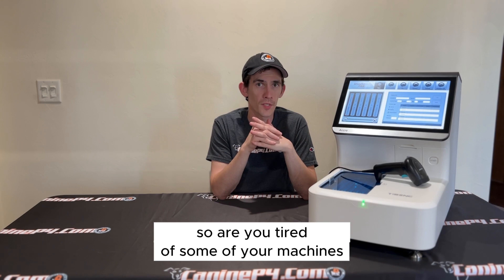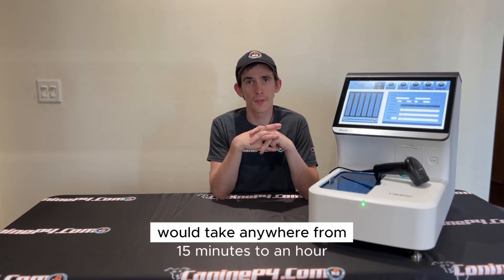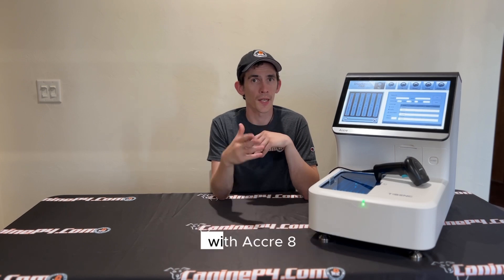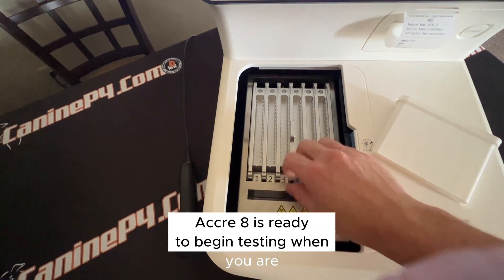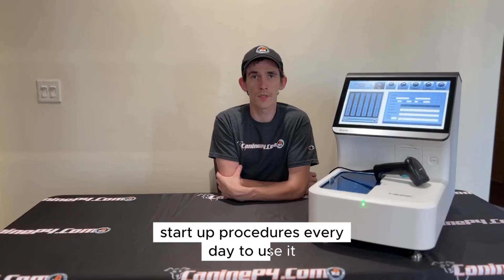Are you tired of your machines having advanced maintenance steps in the morning that take anywhere from 15 minutes to an hour? With the Accre 8, all that goes away. The Accre 8 is ready to begin testing when you are — no advanced 15 to 45 minute startup procedures every day to use it.